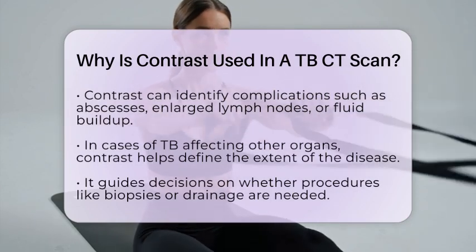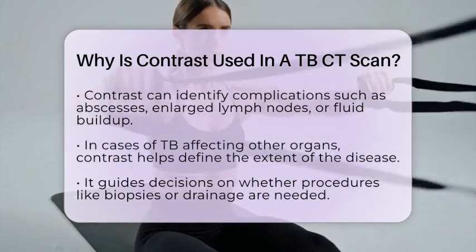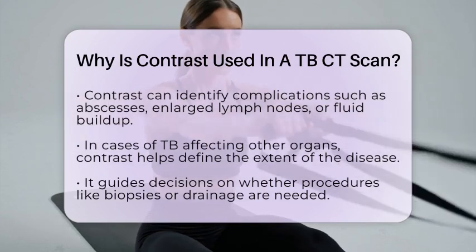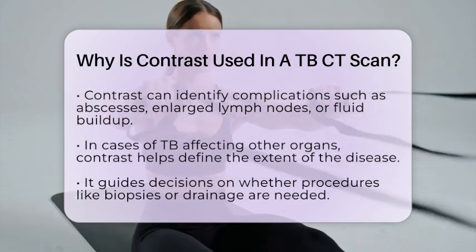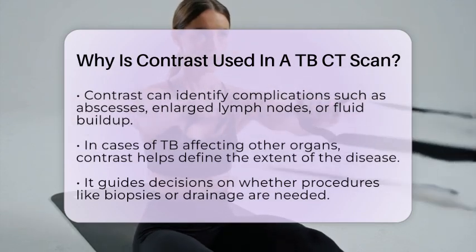In cases of extrapulmonary tuberculosis, which affects organs like the lymph nodes, intestines, or kidneys, contrast helps define the extent of the disease. It highlights abnormal tissue changes, guiding doctors in deciding whether a biopsy or drainage might be needed.